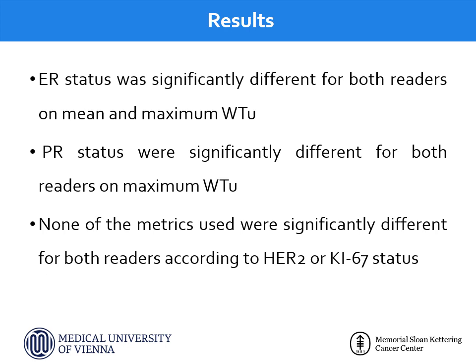Estrogen receptor status was significantly different for both readers on mean and maximum whole tumor measurements. Progesterone receptor status was significantly different for both readers only on maximum whole tumor measurement. None of the metrics used were significantly different for both readers according to HER2 or Ki67 status.